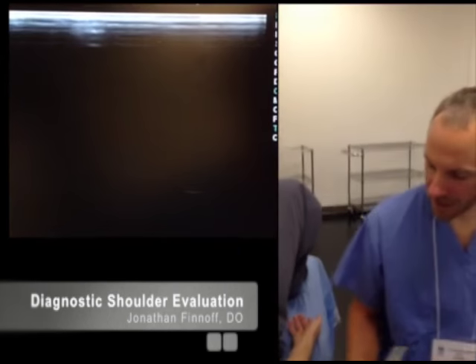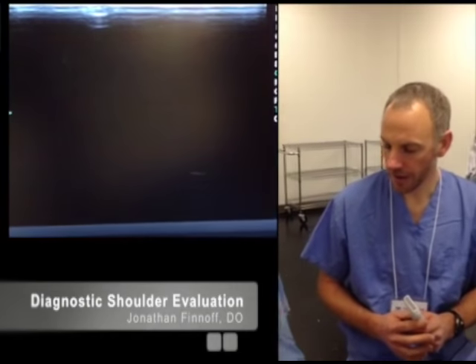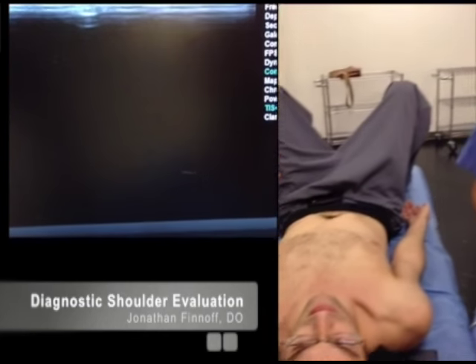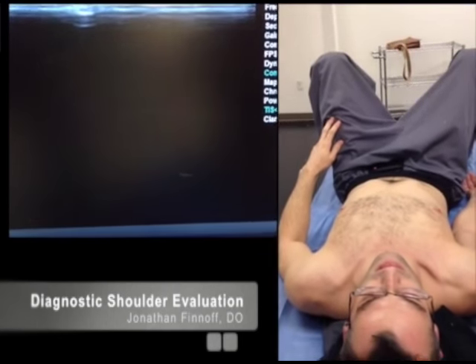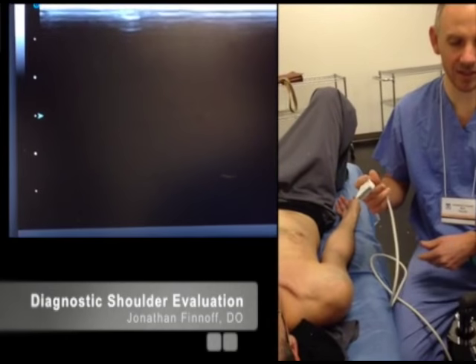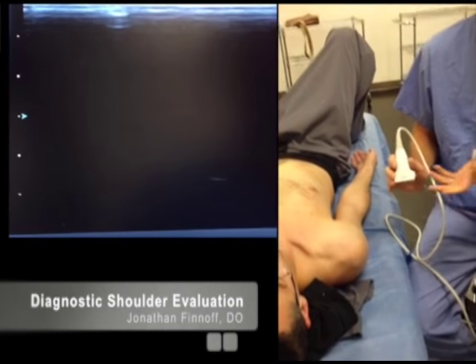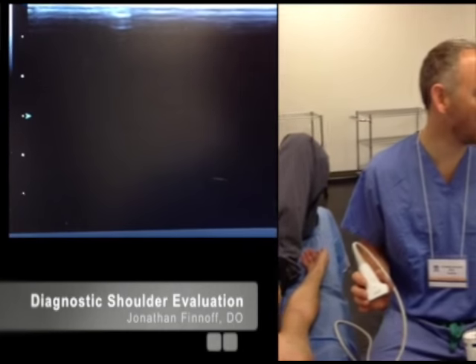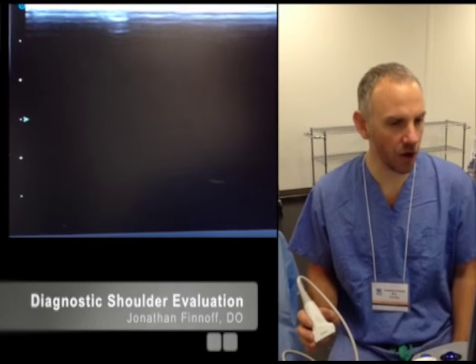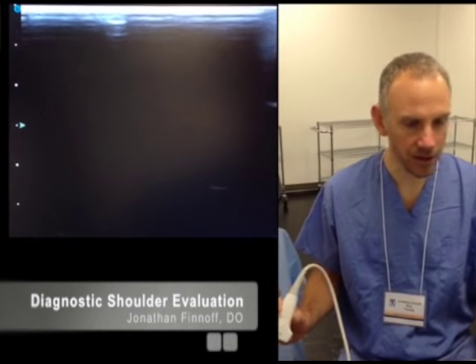To start off with the shoulder examination, you can have the patient in a lot of different positions — seated or lying. I like having people lying down for a number of reasons: it's more comfortable for me, I can rest my arm on the patient, I can throw the cord up on the table so it's not as heavy, and I don't get as fatigued. Also, if I do a procedure, I want the person lying down anyway, because if they have a vasovagal episode and fall, that's going to be a problem.